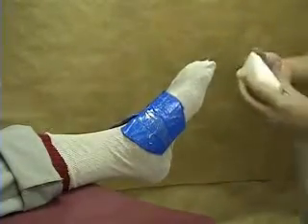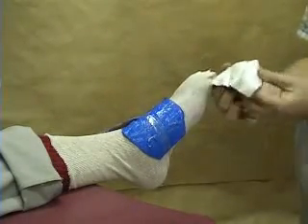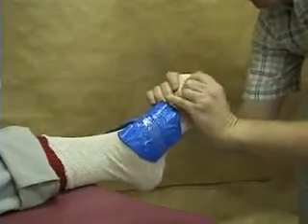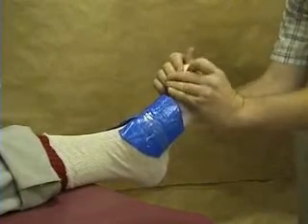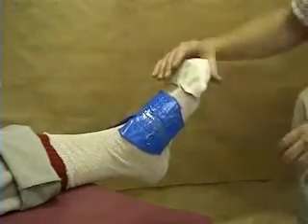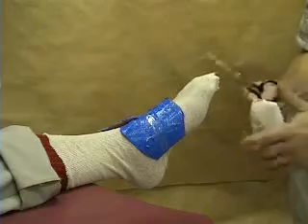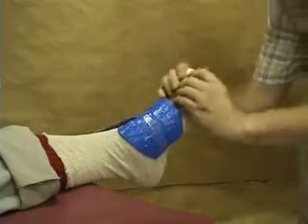So having roughly formed it, I'm now going to remove any sharp edges. To make the boot more comfortable, we'll put it back on. This is a rather ugly one. Now what you can do actually is, while it's soft, it can be trimmed with a pair of scissors, just to neaten it up and also just to reduce the chance of any edges making the boot uncomfortable.